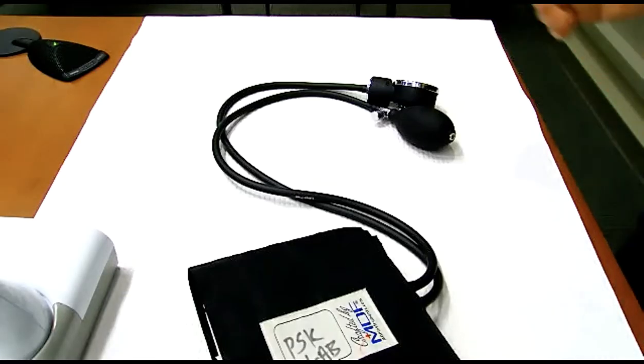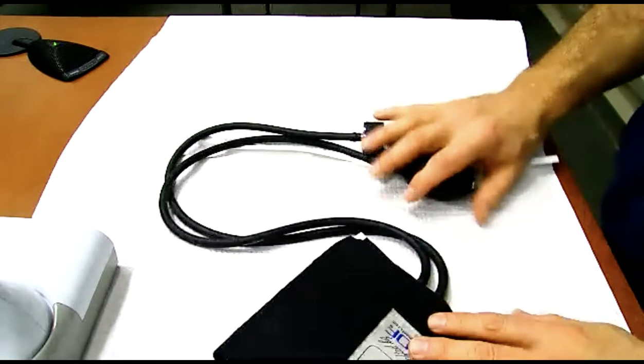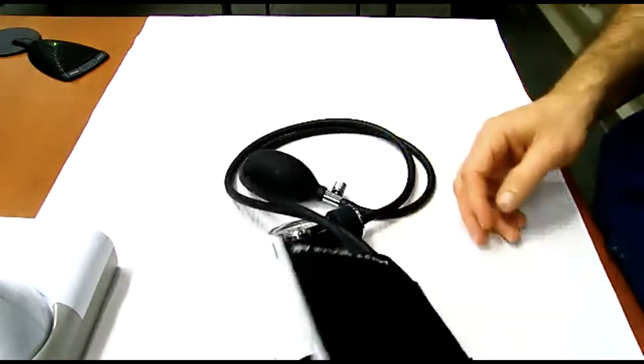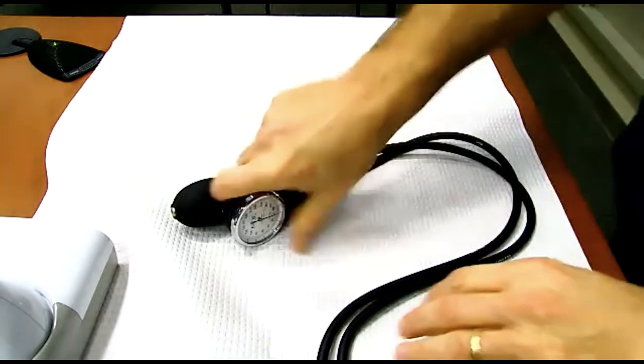Let's start playing with your equipment. So right now, get out your blood pressure cuff. If you haven't taken it out of the bag and messed with it, let's learn about the pieces of the equipment. So get your blood pressure cuff out. And if you haven't attached them yet, we are going to attach the bulb and the manometer and the whole bit. So let's start to look at and dissect your blood pressure cuff. Everyone, get your stuff out and start playing with it. Are you ready? You got it out?